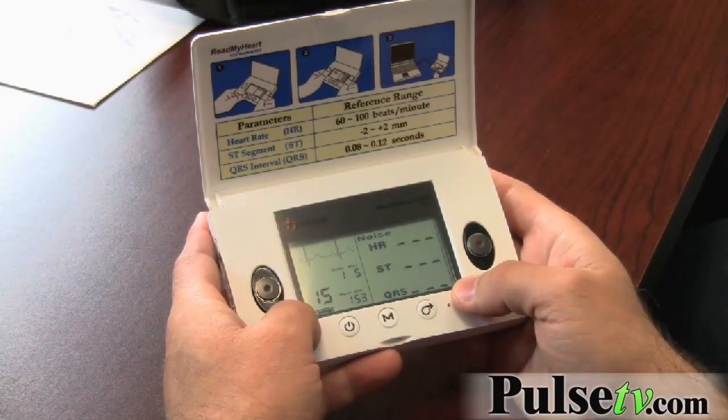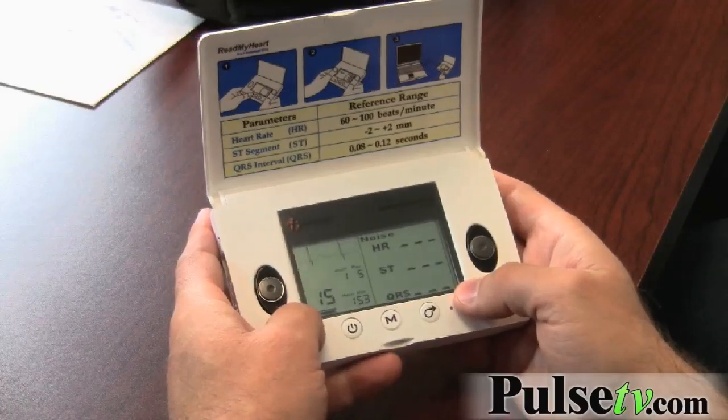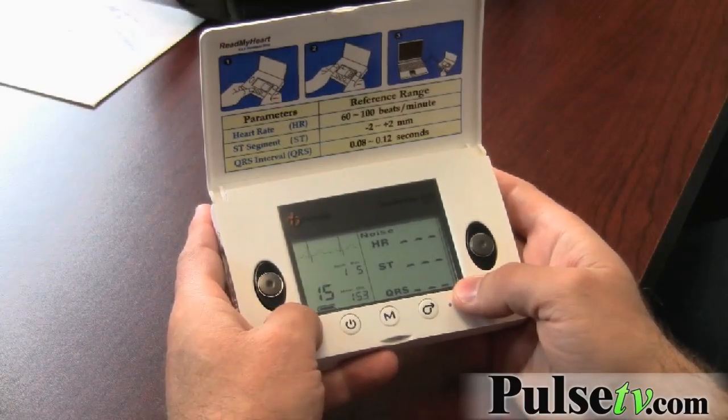It also measures the QRS complex and the changes in your S and T, which are just indicators of how your heart is beating.